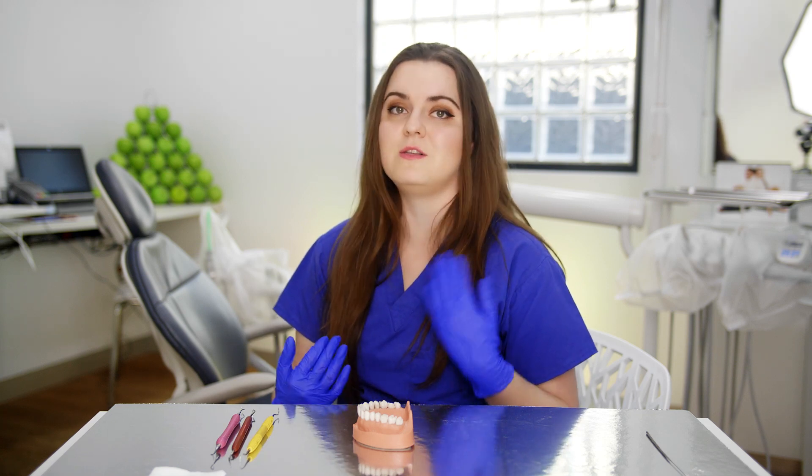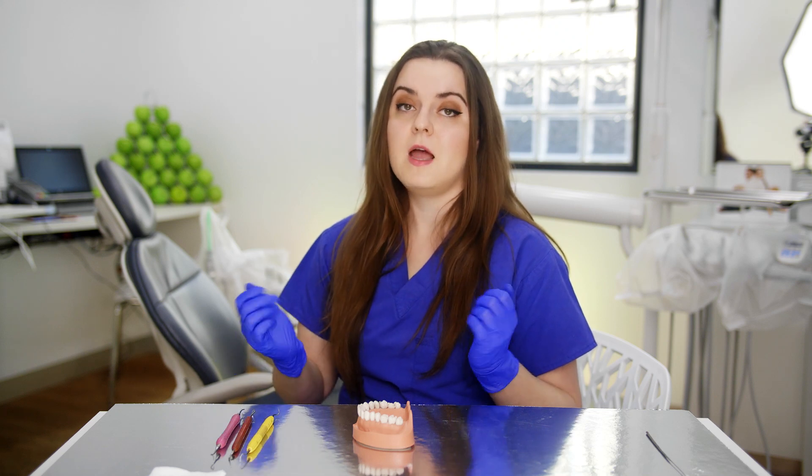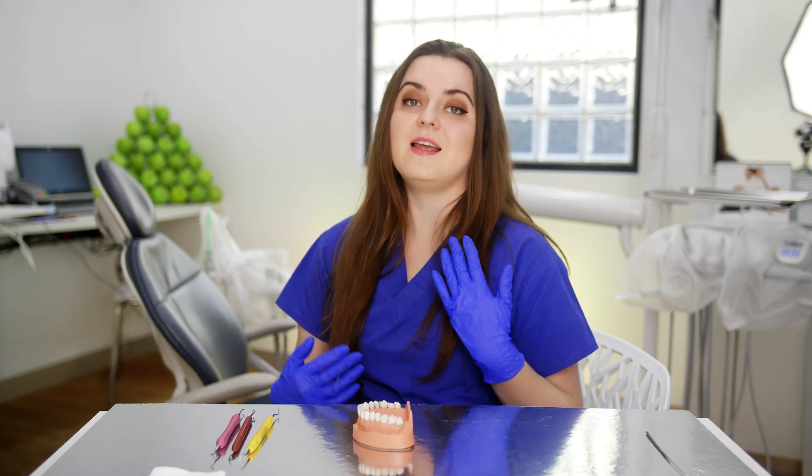Some of you might also be wondering whether it's really worth doing hand scaling — does it achieve the same result as using an EMS or an ultrasonic? In actual fact, yes, you can absolutely achieve the same result, as has been shown by several studies. A study in 1987 by Oosterwall compared the two and found there were absolutely no microscopic differences between using hand scalers and ultrasonic instruments. But I must add that it is technique dependent, which is why I wanted to do this tutorial.